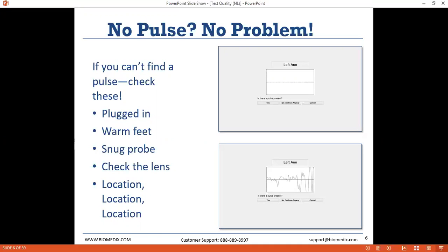And in some cases, I know offices leave a towel or a light blanket by that testing location to place over the patient's feet and keep them out of the chilly air. Just like we mentioned on the last slide, if you are seeing some unusual results or aren't getting a strong pulse anywhere, there's a lot of artifact, you're going to want to check to make sure that there isn't light that's getting to the light-facing sensor.